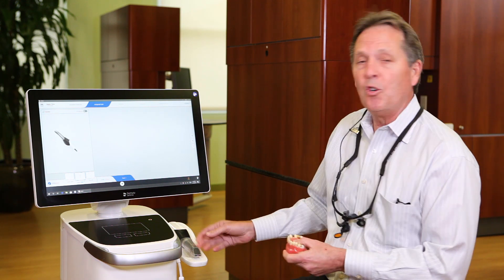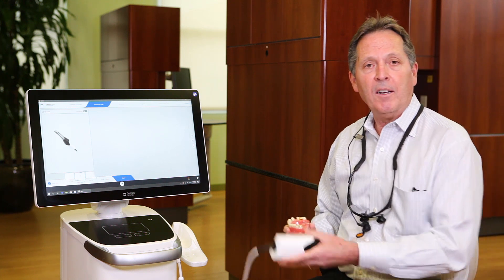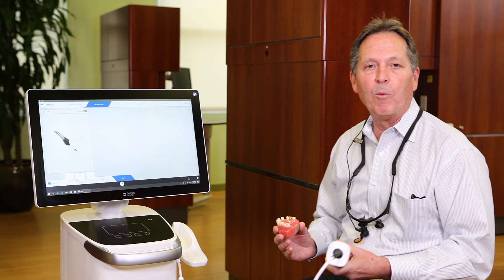So let's take a look at this. There are two ways to start the camera. If you have it on auto-start, it'll just start as soon as you pick up the camera. If you don't like that, you can turn it on and off with the foot pedal.